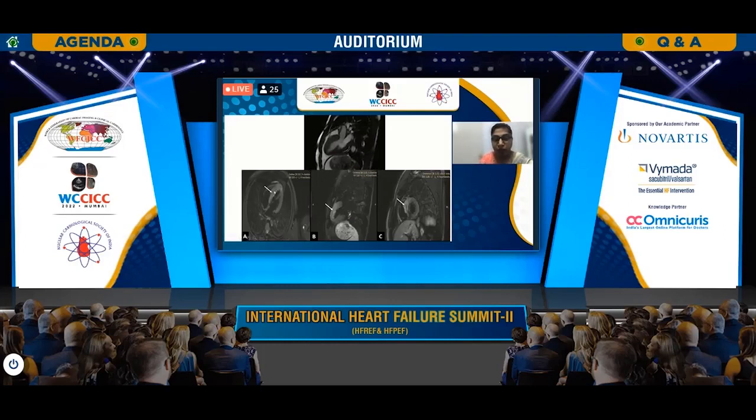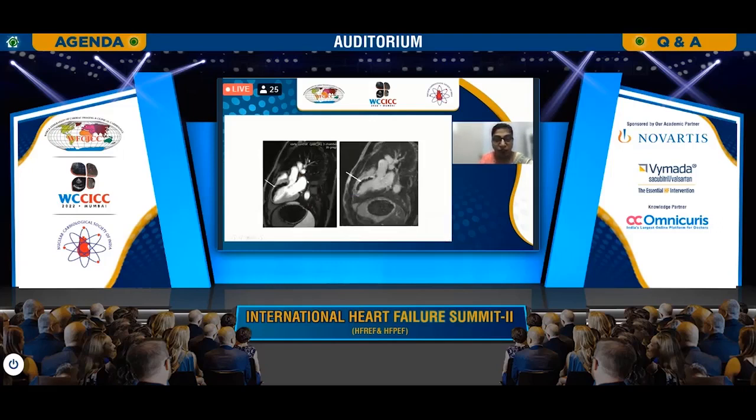On T2, there was edema, which was picked up on all the sequences. But when the perfusion sequence was done, what was seen was that half of the thickened myocardium did not pick up any contrast at all. So this was suggestive of a thrombus or an infarcted region. And late gadolinium enhancement was done, and it showed that the rest of the myocardium, which was showing some enhancement, now retained the gadolinium, suggesting there was fibrosis. So there was an infarct in the anterior wall with an underlying adherent thrombus.